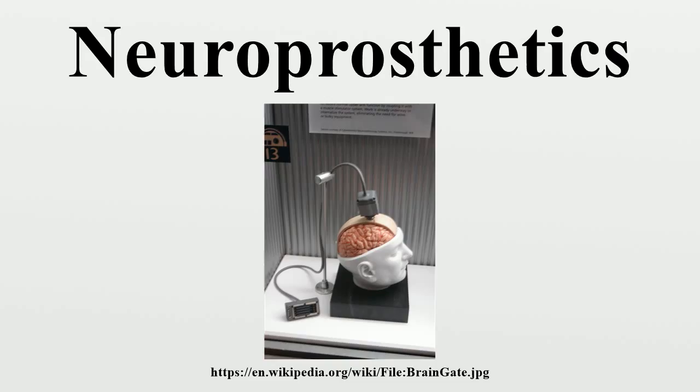Pacemaker technology, which had its start in 1950, became available. Melzack and Wall published their gate control theory of pain, which proposed that the transmission of pain could be blocked by stimulation of large afferent fibers. Pioneering physicians became interested in stimulating the nervous system to relieve patients from pain.